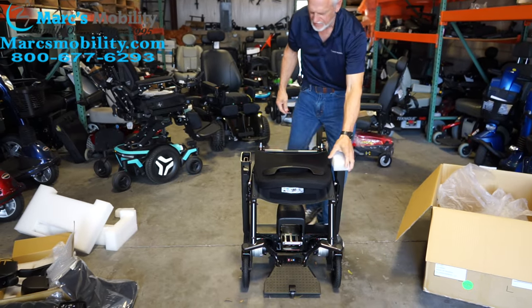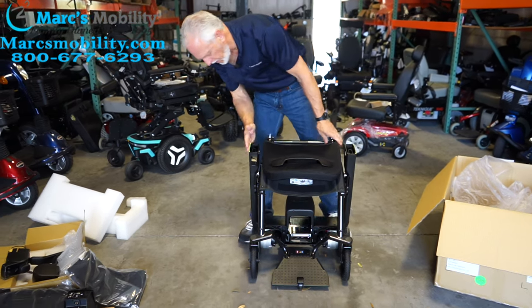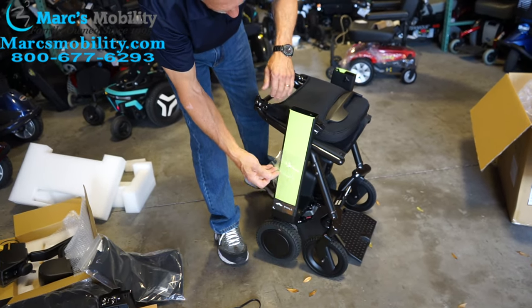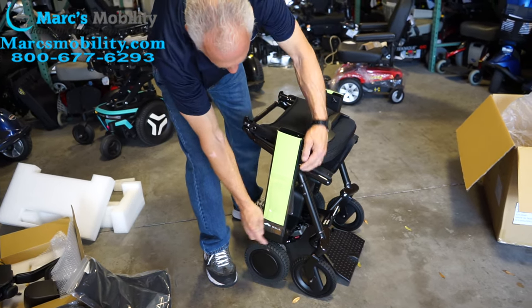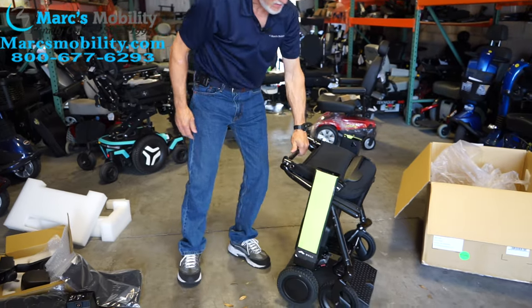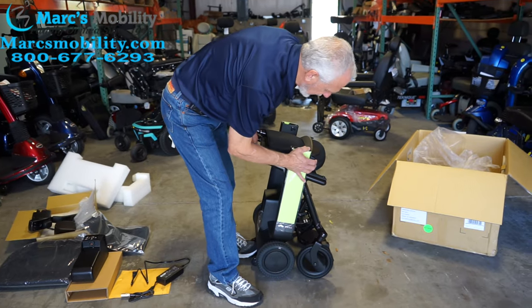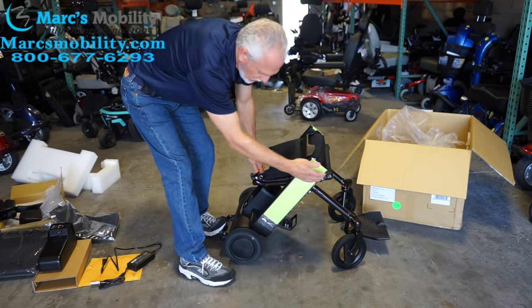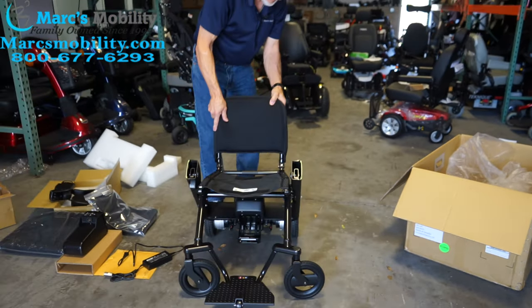When you have the chair sitting like this, we'll take this foam off. It already has the color installed — this color is a greenish color, it's already on here. If it's not on there, it just snaps on. Sometimes they send these colors separate. So when you want to open this chair, put your foot over here on the bottom so it doesn't move forward. Right here is a little lever — you push it in and that unfolds the chair. Pull the seat out, and now you can see the chair is unfolded.